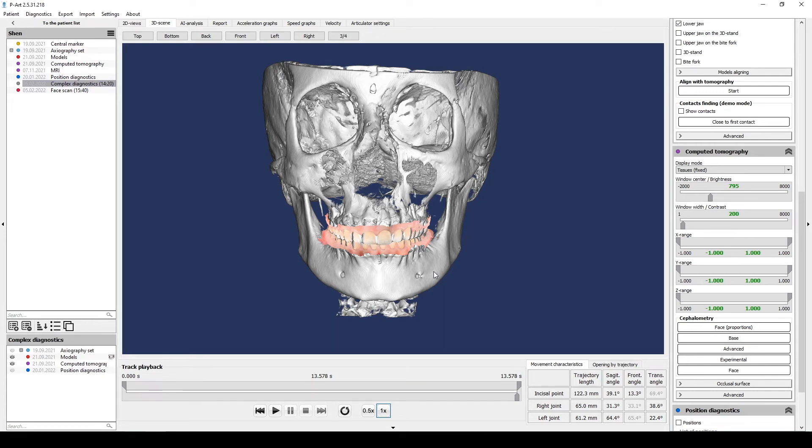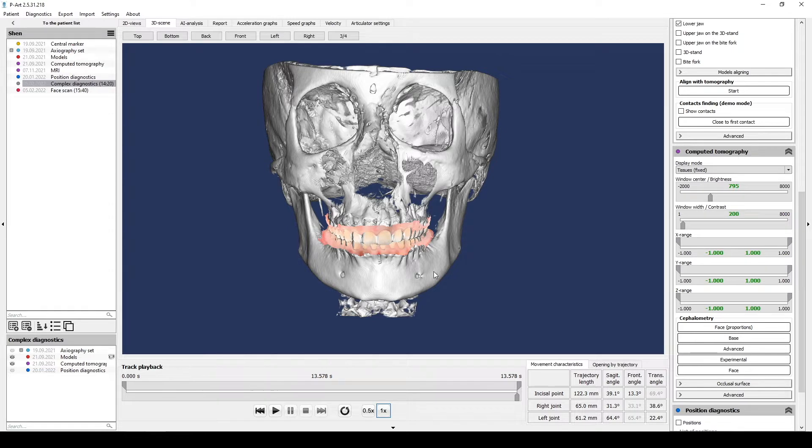Occlusal Plane Construction and Options of its Space Orientation. For this we need individual models and CBCT, where we will use advanced cephalometry. Let's go through a simple digital protocol.